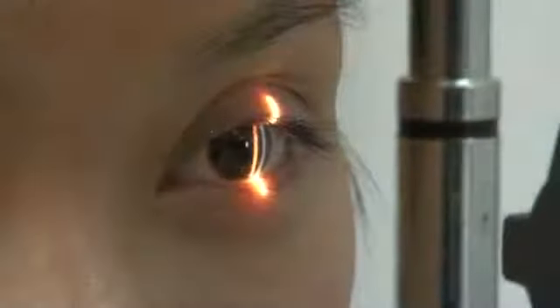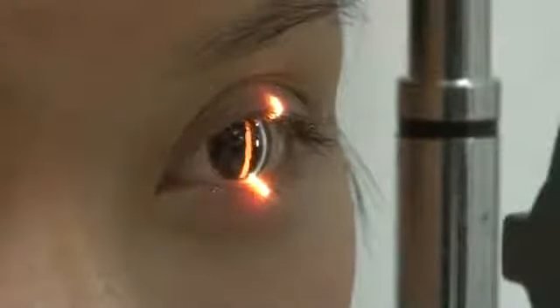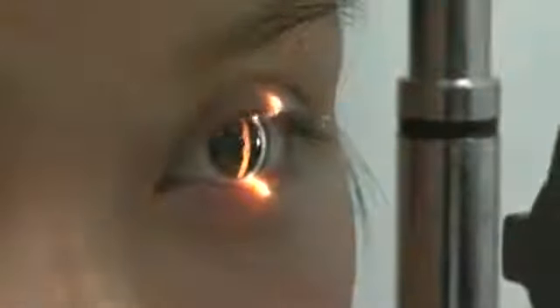First, focus on the cornea and set the magnification to low. Position the light source at about 45 to 60 degrees. Adjust the light source to about 2 mm wide and rotate it out of the click-stop position to illuminate at the limbus area. A halo of light is observed around the entire limbus as the light is transmitted throughout the cornea. The normal cornea appears dark since the light is being internally reflected.